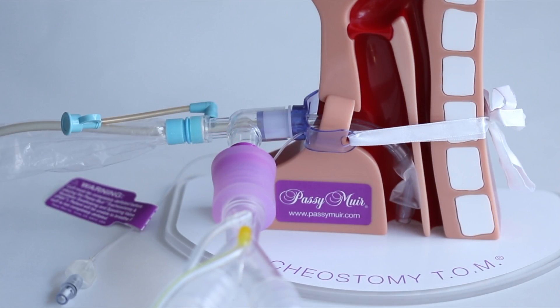When using the elbow-type inline suction catheter, the PMV-2001 purple valve can be placed directly onto the distal end of the suction catheter connector, since it is 15mm outer diameter and the PMV-2001 purple is 15mm inner diameter.